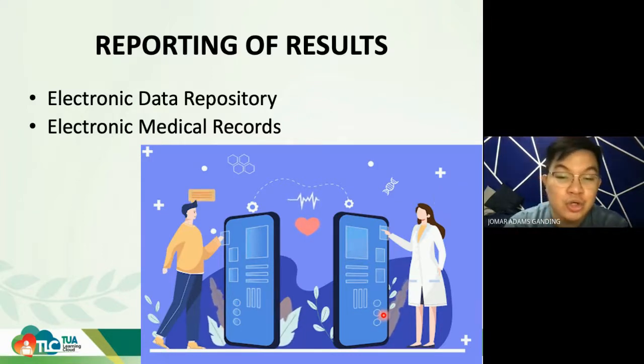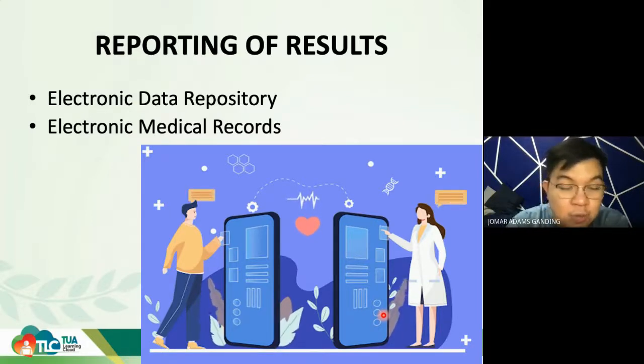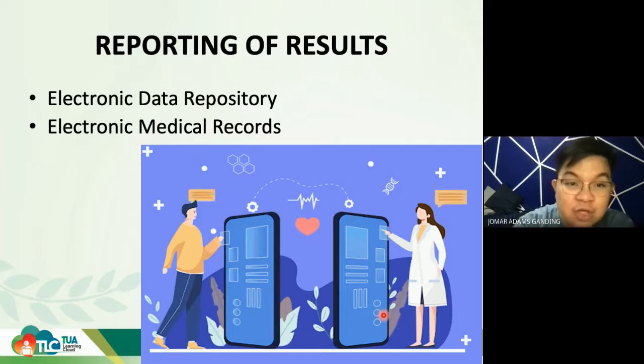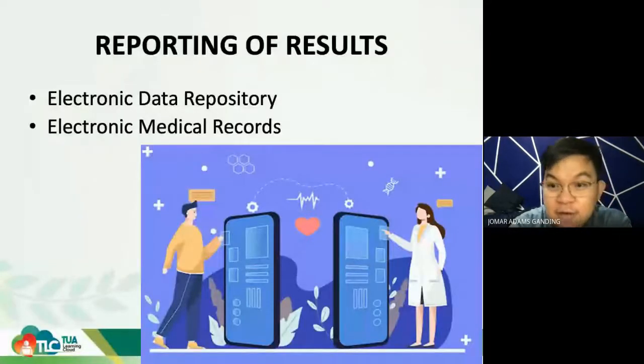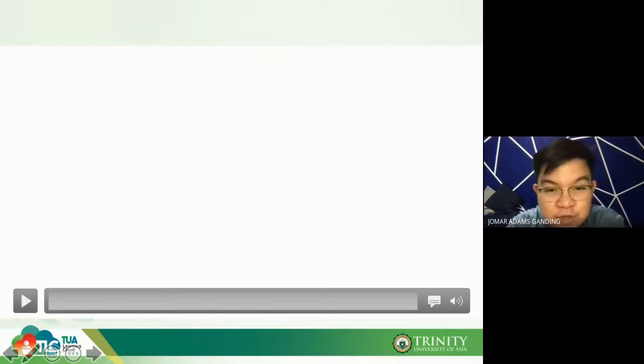Now I'll show you a video of how beautiful a fully automated laboratory looks — from receiving the sample all the way to releasing the results — so you can see the automation at work.